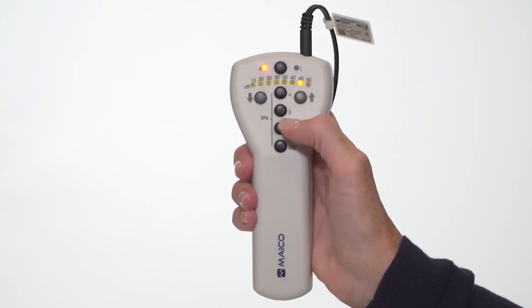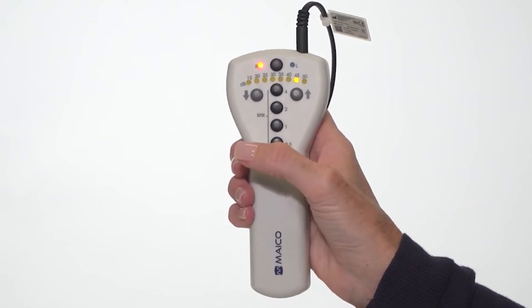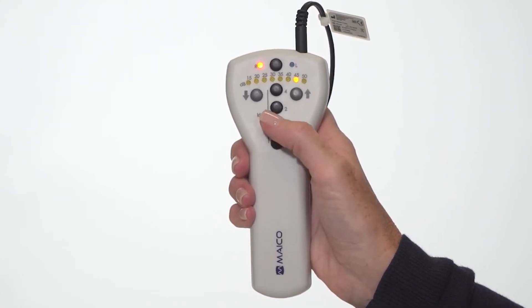Once set, present the tone by pushing the test frequency button for one to two seconds. Each frequency button is also the tone present button.